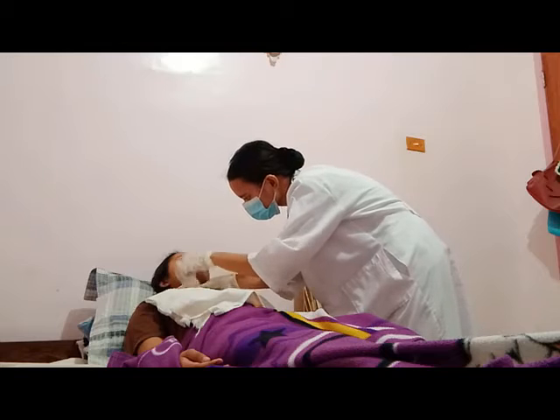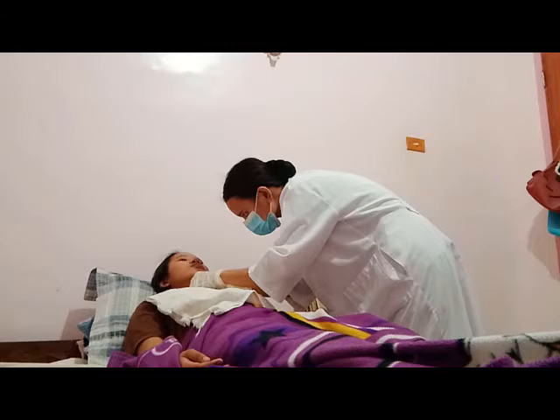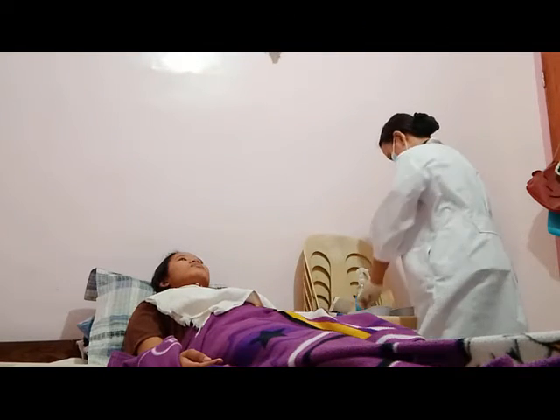Pat the skin gently with a dry 4x4 gauze sponge. Slide a commercially prepared tracheostomy dressing or pre-folded non-cotton-filled 4x4 inch dressing under the faceplate.